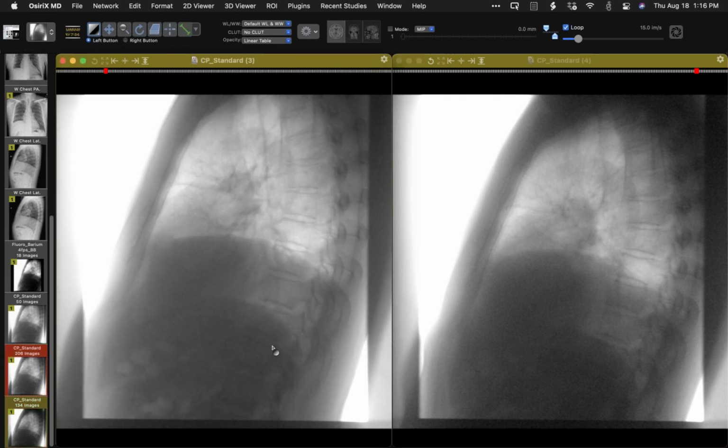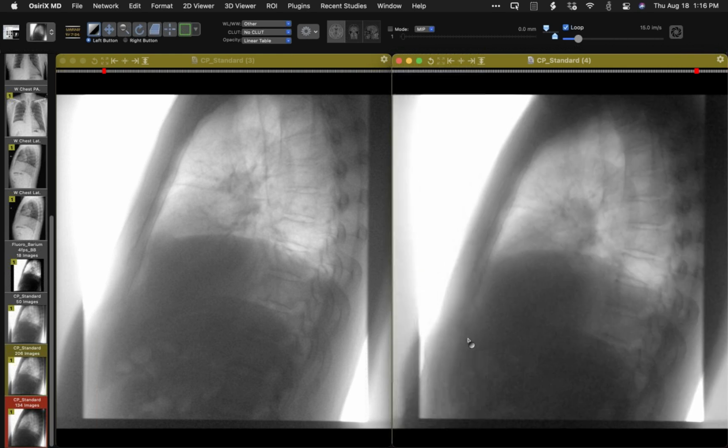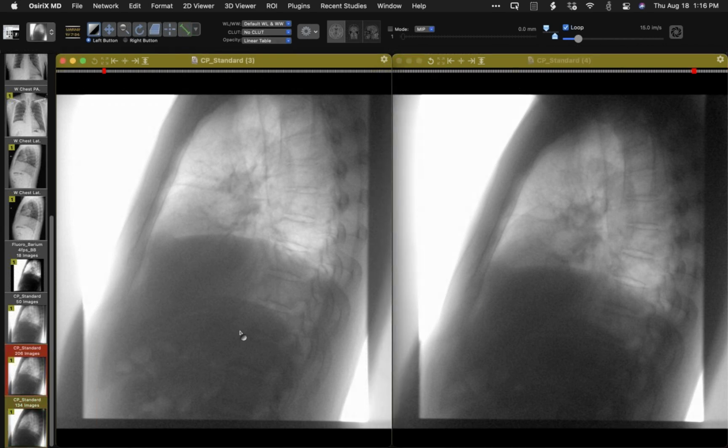Any comments, David? Yeah, so paradox does not mean paralysis. It just means relative weakness. So they both start with P, but paradox does not equal paralysis. So it's like arm wrestling. If you have a contender like me who's skinny and you have a muscular dude, there will be paradoxical motion of my forearm. It will go backward because the other guy is going to overwhelm me. But it doesn't mean I'm paralyzed. It just means that I'm weaker than the buff dude. So paradox equals relative weakness, not paralysis, as long as people don't get the wrong idea.